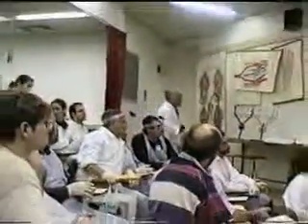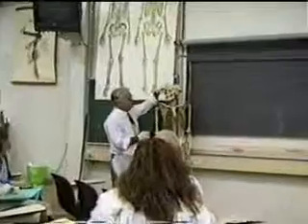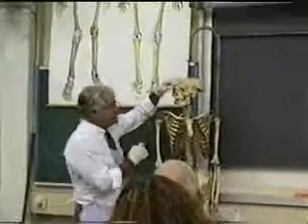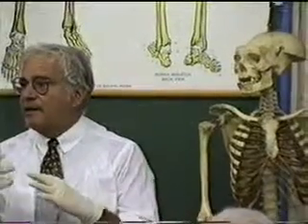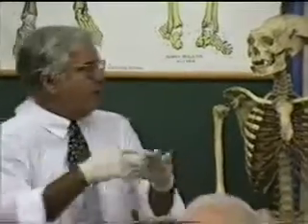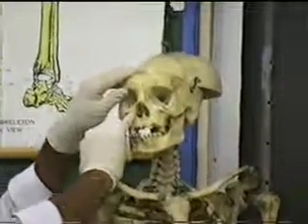because it will tell you, without dissecting away from the nose, exactly how little the bone really contributes. And when you engage an osteotome, to make a cut through bone with a chisel, chisel's the right term here, what you're doing is engaging it at the piriform aperture.